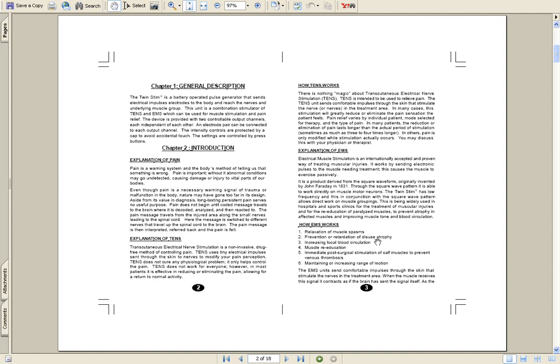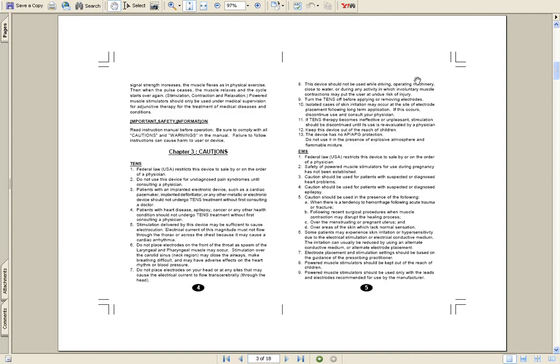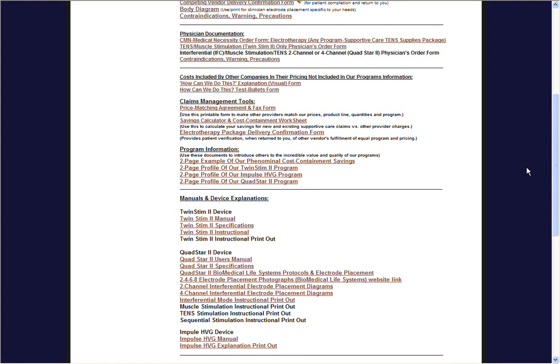Prevention or retardation of disuse atrophy, increasing local blood circulation like a massage, re-educating the muscles, and maintaining or increasing range of motion. So you can look at all our devices, they have the manual online. You can read specifically about those.